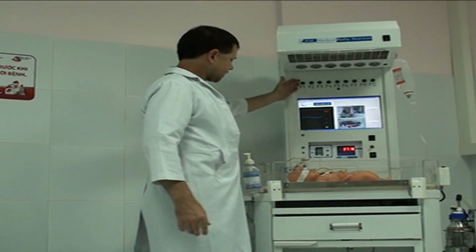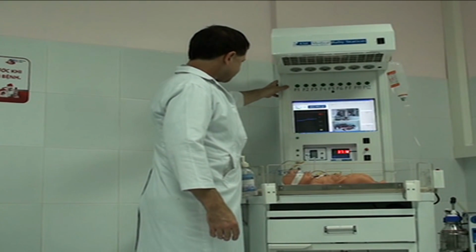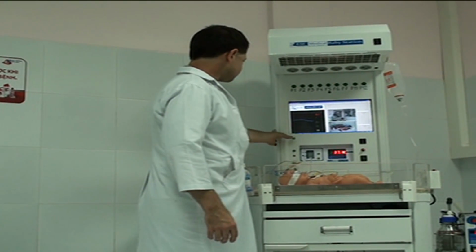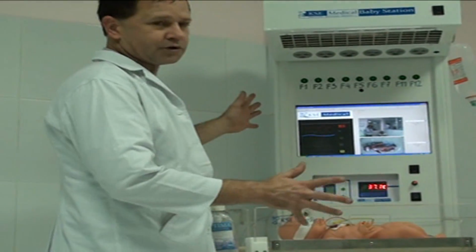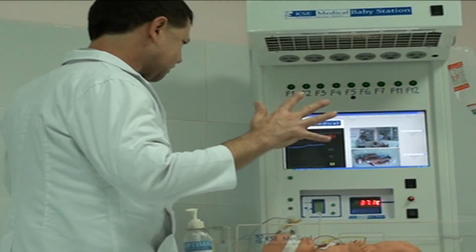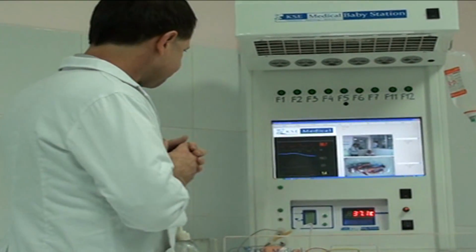We have the hot keys up here, and if you walk up to the machine as a new user, you can push this one button and this will play a video to teach you how to use the machine. So even if you know nothing, the video will walk you through it.